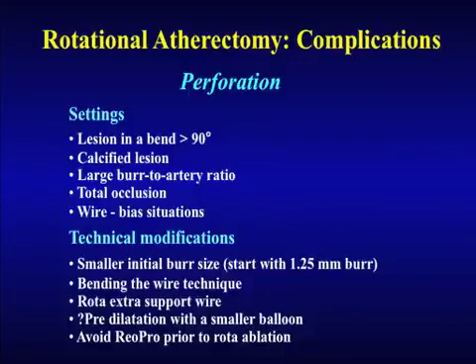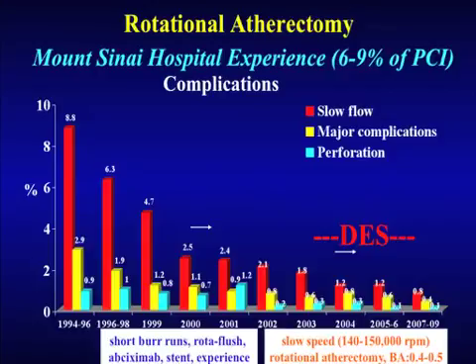And perforation of course occurs in the angulated lesions, so you need to be careful and use a small burr with careful technique. And these are the data at Mount Sinai, that overall complication rates have decreased over time with these techniques, and slow speed really works very well.